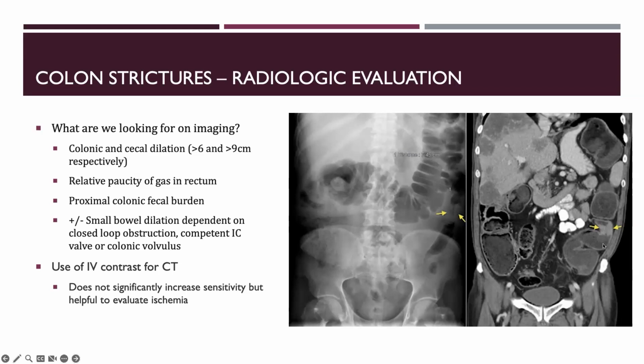On CT scan, you can see the same things, but to a much greater detail. Here you can see an obstructive endoluminal mass that is pretty much constricting the entire lumen. You can see dilation and here that fecalization of that proximal small bowel. What we can also see here, and what I'm assuming you all can see as well, is this mass has metastasis to the liver. And so it's atypical that we just take an x-ray and we go from there.